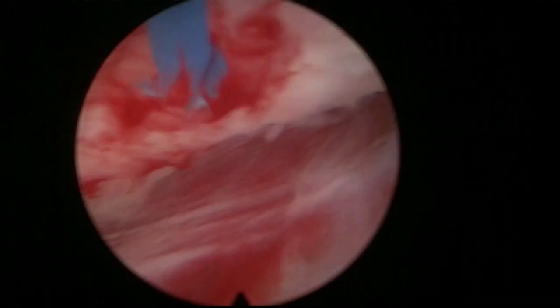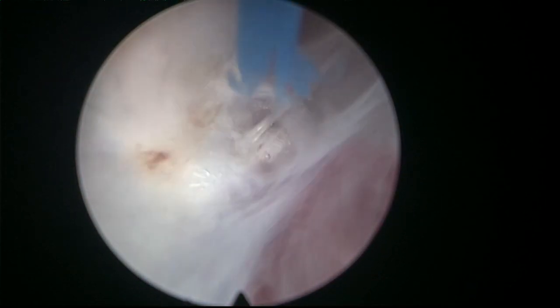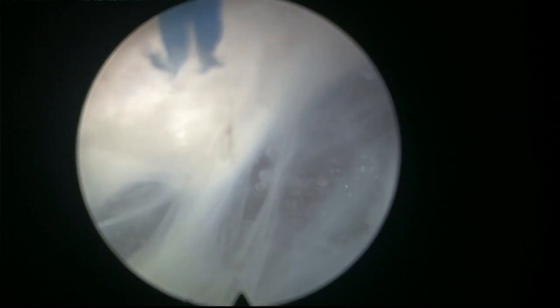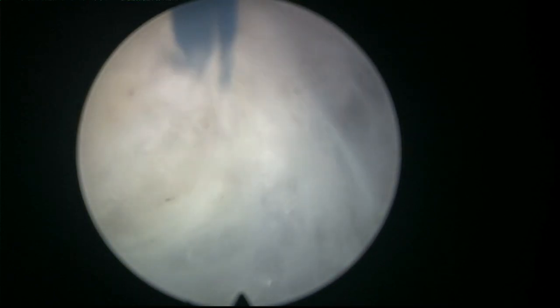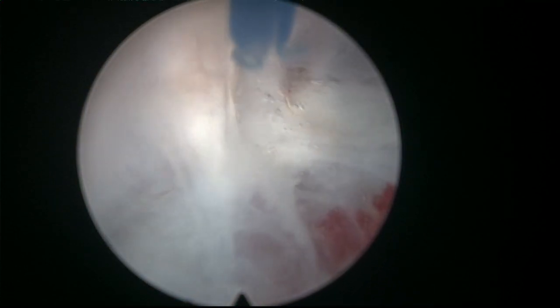So that's the posterior plane. That's the bladder neck, you see? So we need to continue. We need to be very careful here, trying to continue close to the adenoma. See, close to the anterior aspect, close to the adenoma. Like that. You see, if you went this way, it would be a problem. But as long as you stay close to the adenoma, you see that we are respecting that layer of capsule there, which might be a little bit thin.